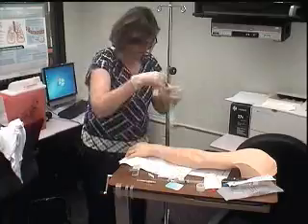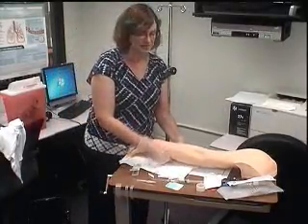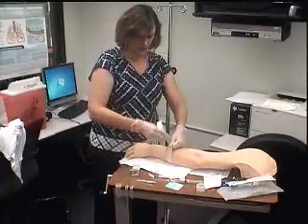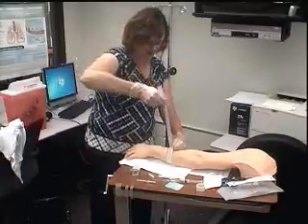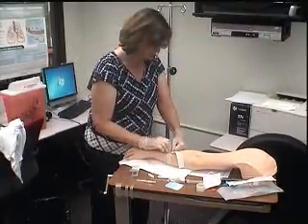So I'm going to go a little bit above where I think I'm going to go, but like I said, I don't know for certain until I get this tourniquet on. So I take the tourniquet, I hold it in one hand, I pull with the other, and then I tuck it under. I want to be able to loosen it when I need it.